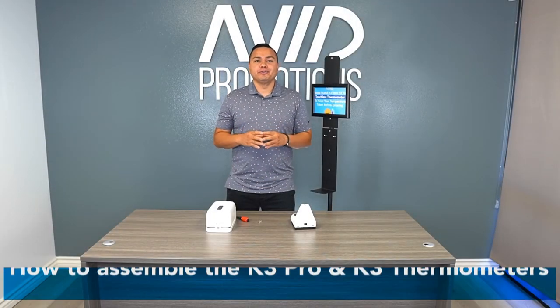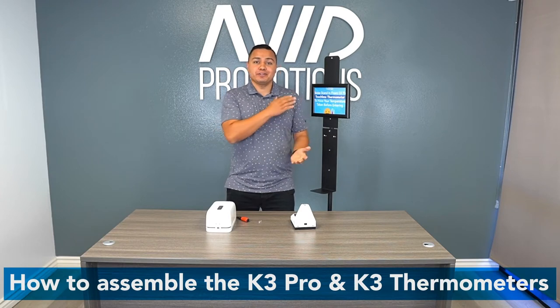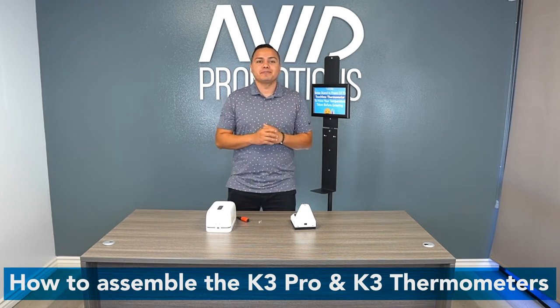Thank you for purchasing your K3 or K3 Pro stand. Today I'll walk you through the setup. Let's get started. We're going to start with the stand, go into the thermometer, and then with the dispenser.